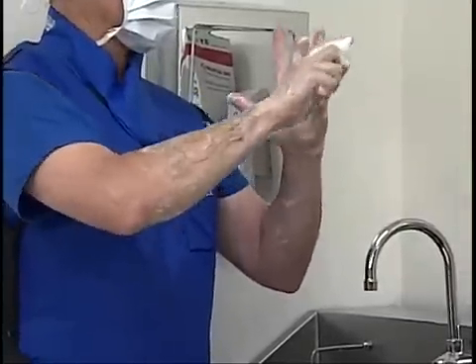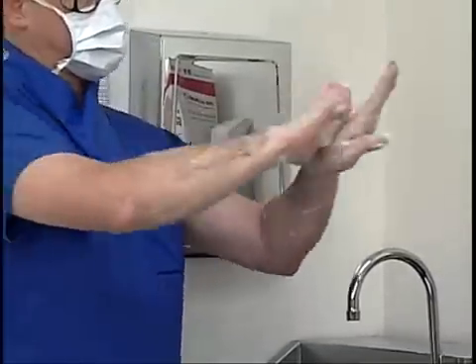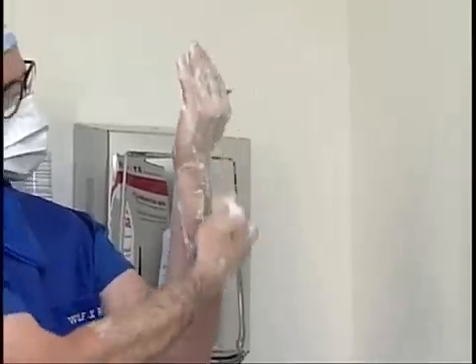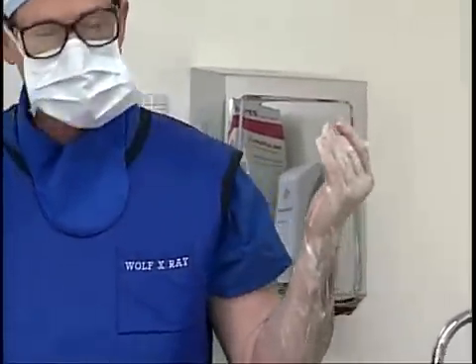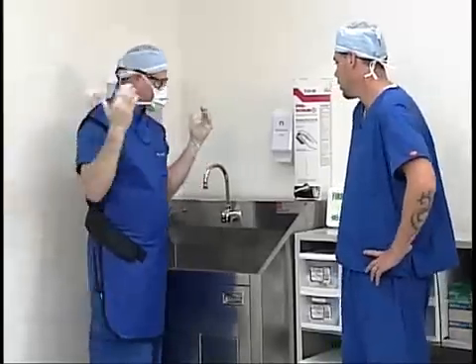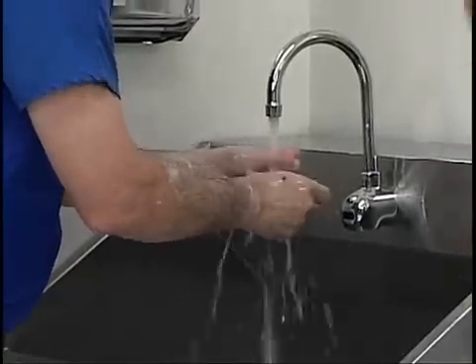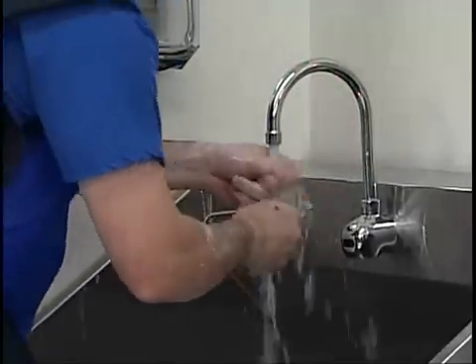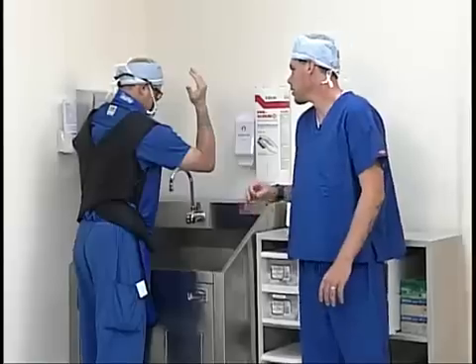This whole process should take approximately five minutes. Now that Scott has completed scrubbing his hands he's going to discard the sponge and go ahead and rinse. When he rinses he's going to want to make sure he rinses from fingertips to elbows, swooping his arms up underneath the water.